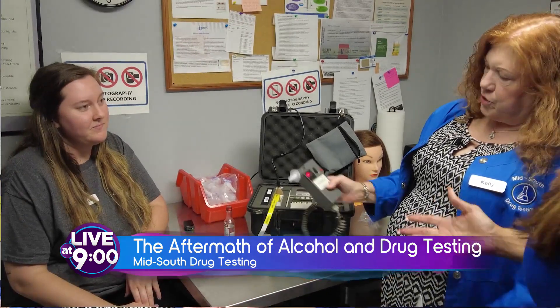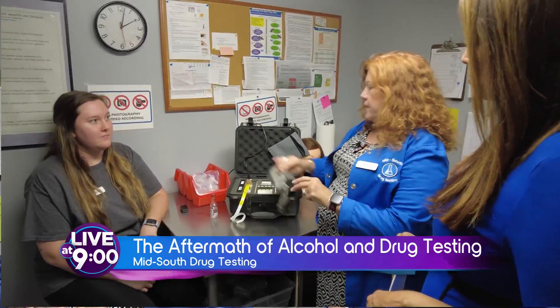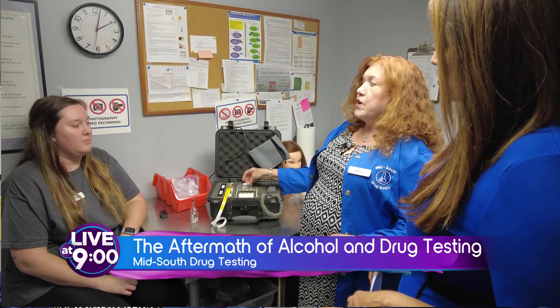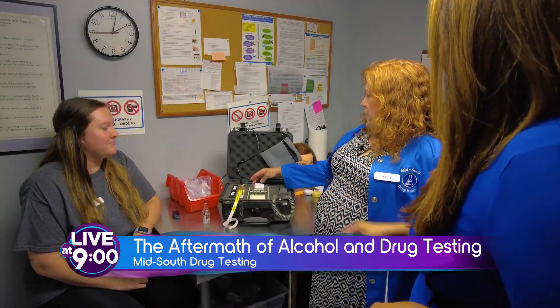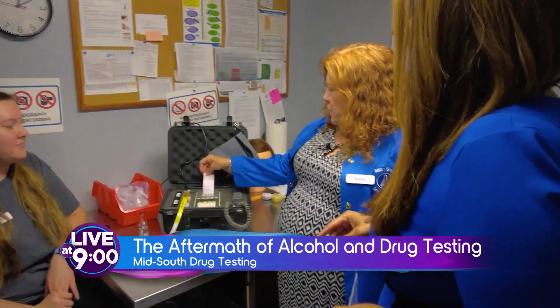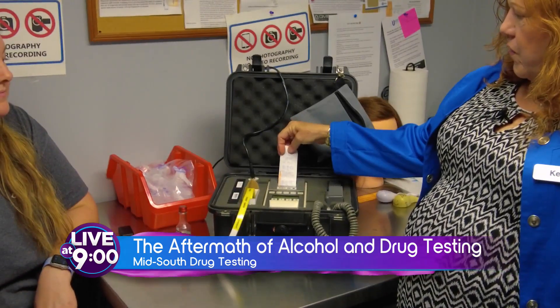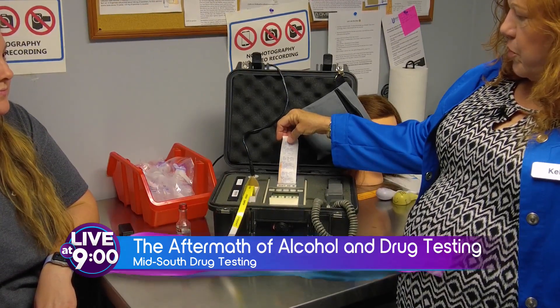Oh wow. Point .282. So our legal limit is .08, so .282 would be very drunk. Very. It's printing three different pieces of the receipt because an alcohol testing form is a three-part form.